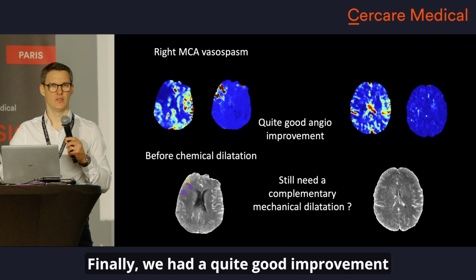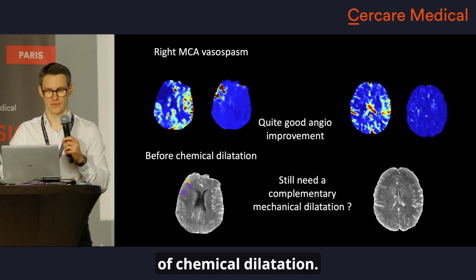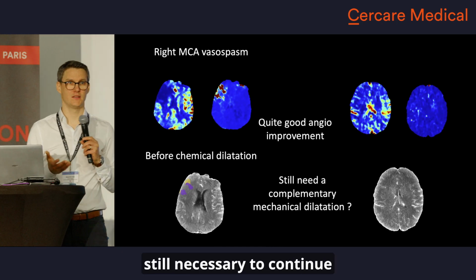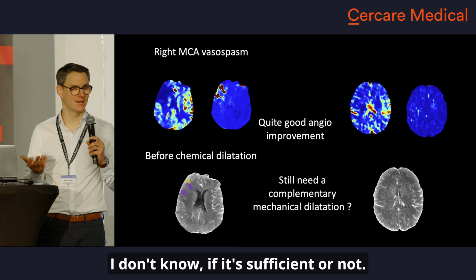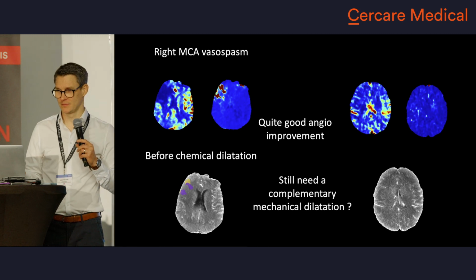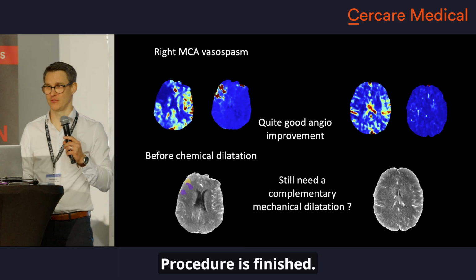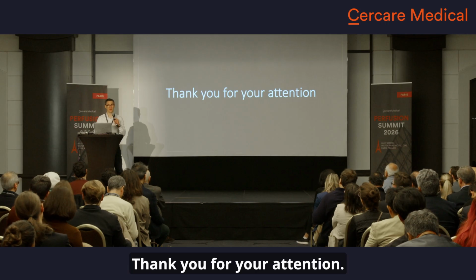Finally, we had quite a good improvement after just 30 minutes of chemical dilatation. So as I said, is it still necessary to continue, or can I go back home? I don't know if it's sufficient or not. We redo a scan, almost normalized, I can go back home. The procedure is finished. Thank you for your attention.